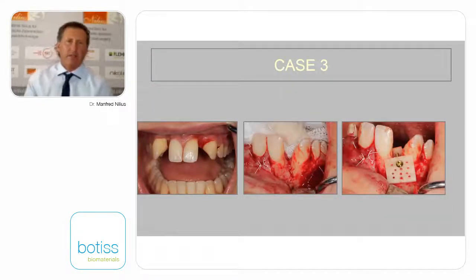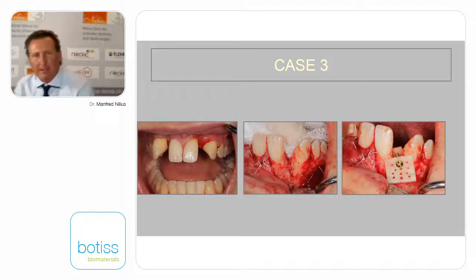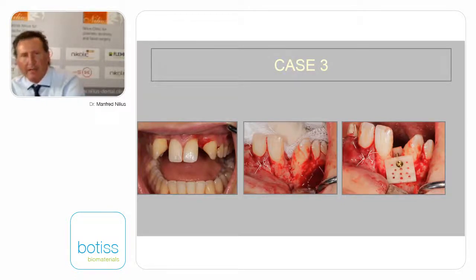Okay, this clinical situation, and this picture shows you what orthodontic treatment can do. We have a very good condition, and the gap here of the coronal part is okay, but no way to put in some implants. And when you have these cases, you have to talk to your orthodontic colleague to make sure that the roots are different, that they're not in the same direction.